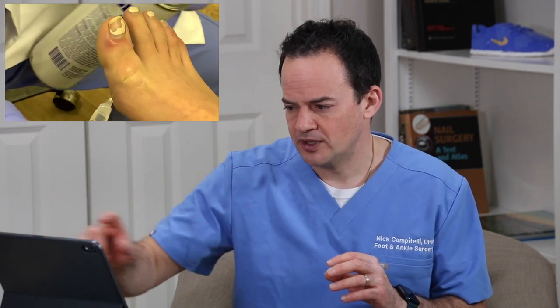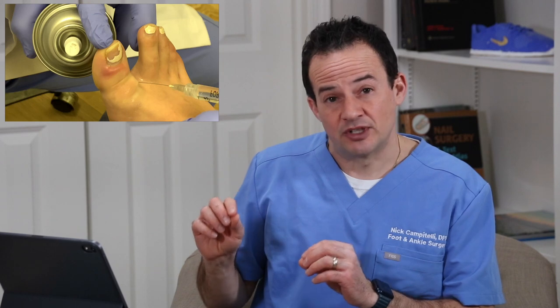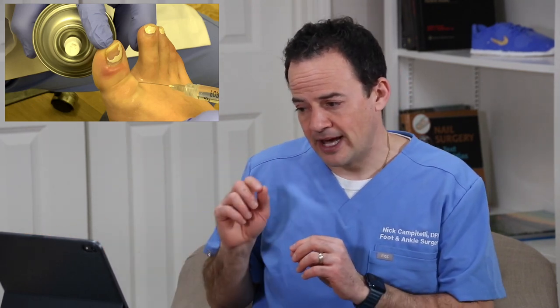I did that first injection, then we slide the needle over and get under the extensor hallucis longus tendon on top of the toe. After that, we use more cold spray and address the dorsal digital lateral branch, then pass the needle to the plantar aspect of the toe. We're performing this in a ring — you can hit all four branches with just two needle pokes, but from experience it's best to bathe the entire toe with the anesthetic agent to do a better job numbing it. Most patients don't want more than one injection if they can avoid it.